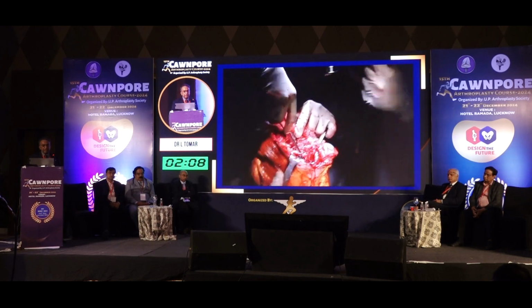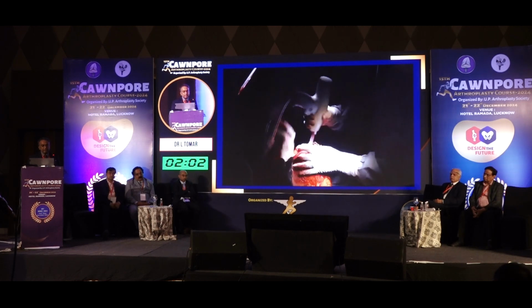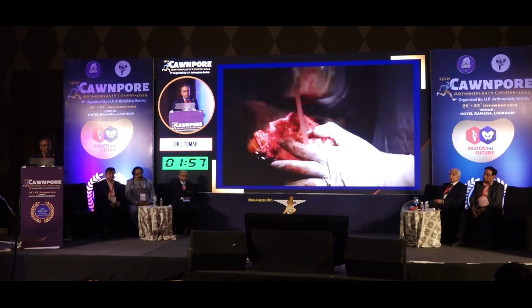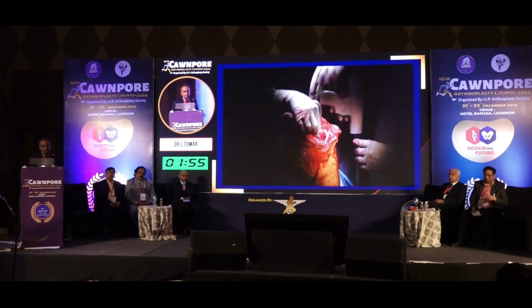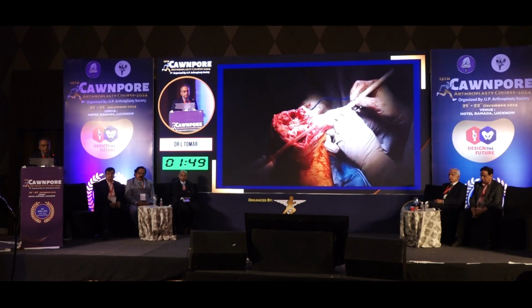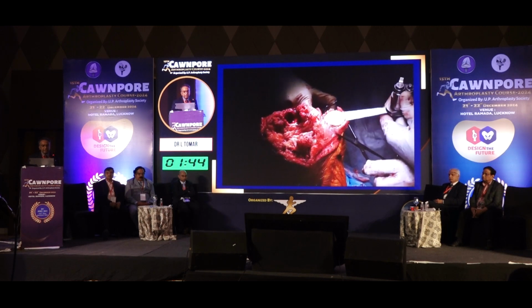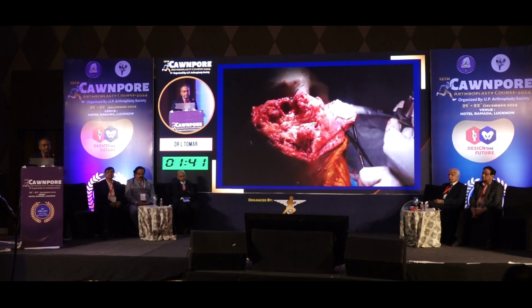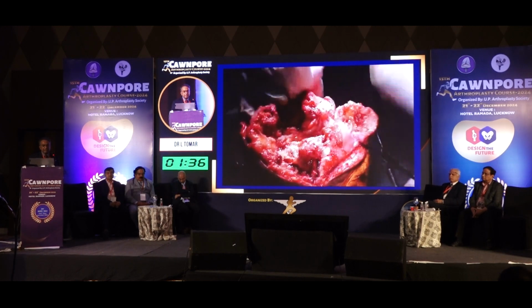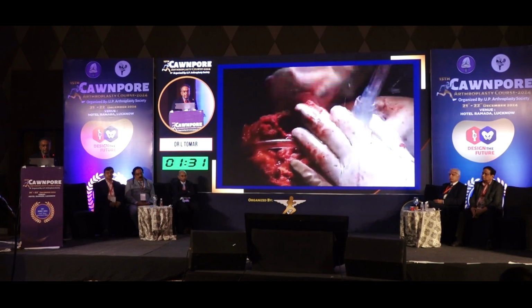After removing the cement from the medullary canal, we clean it out, and then suction lavage of the entire surfaces is done. Remove the leftover cement and the granulation tissue, and take all the samples, almost 6 samples from medial, lateral, posterior, and the medullary canals. Then come to the patellar side, do the debridement of the infected tissue and granulation, and remove the patellar button with the thin saw blade again. After thorough debridement, take the samples and clean it out with the help of a nibbler.